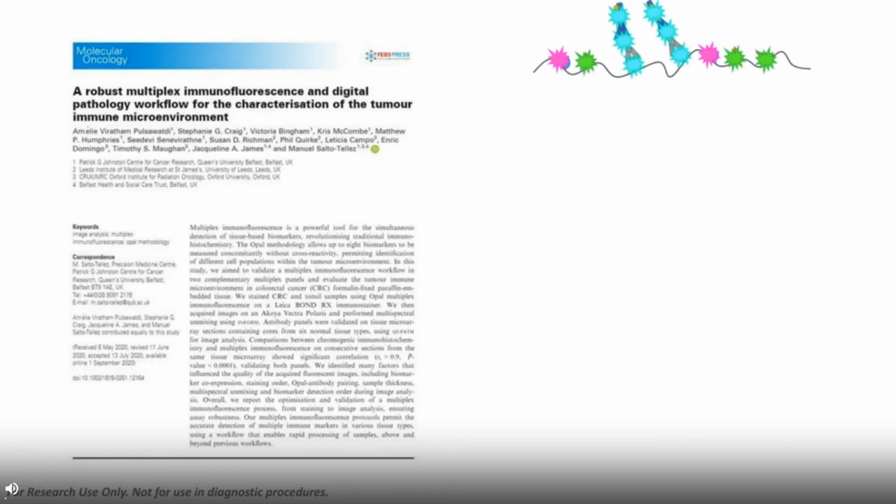This isn't novel. This has been around for a long time. We've been able to do multiple rounds of staining as long as we've been able to do immunohistochemistry. However, as I mentioned earlier, there's been advances in the polymer detection technology and also the dyes that are available to conduct fluorescence. One of the problems with using this indirect immunolabeling method is known as steric hindrance, and this occurs whenever these dye reaction products are developed too close to each other.